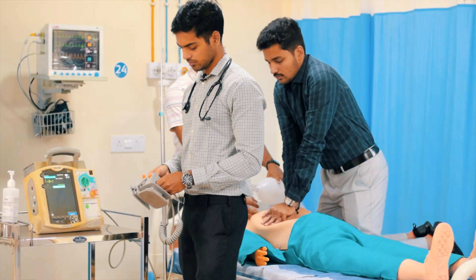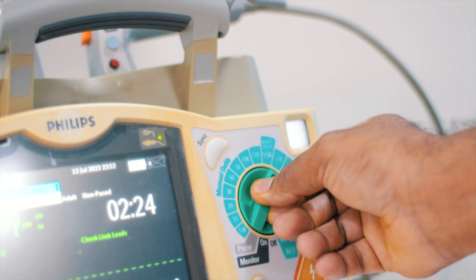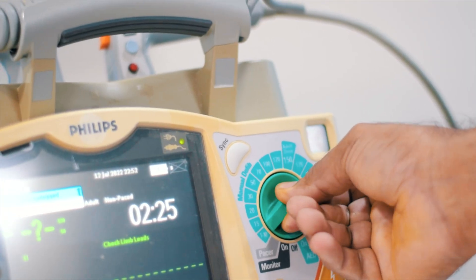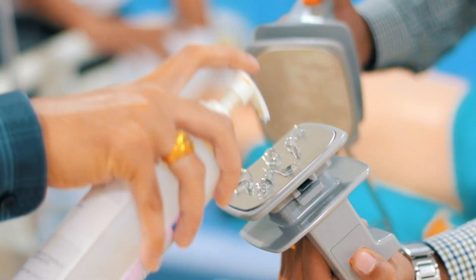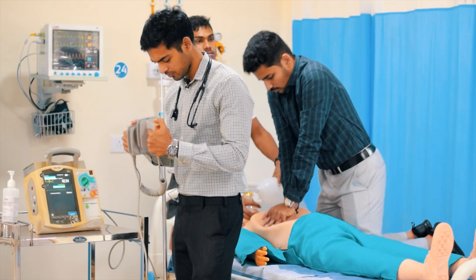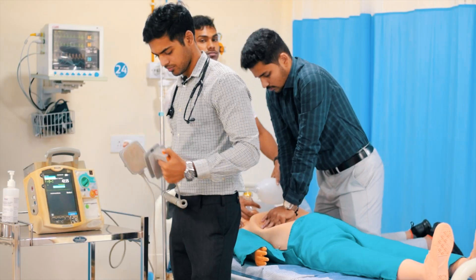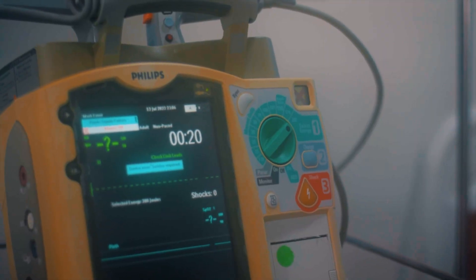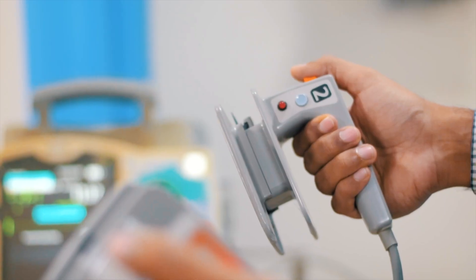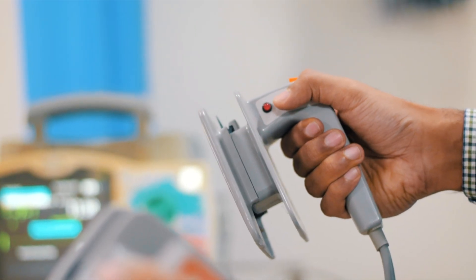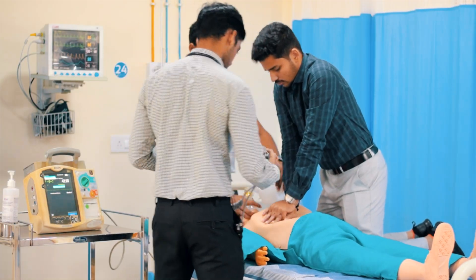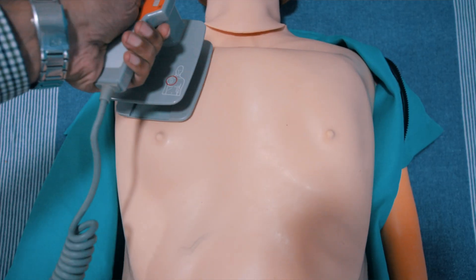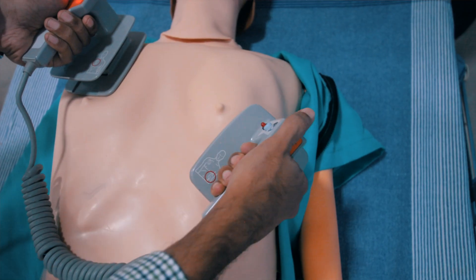Now let's demonstrate the procedure. After you have selected the appropriate energy level according to the scenario, you need to lubricate the surface of the pad with gel to make proper contact with the skin. Next, charge the paddles by either pressing the charge button on the machine or on the paddles. Then place one of the paddles over the right side of the sternum and the other over the apex according to the labeling.